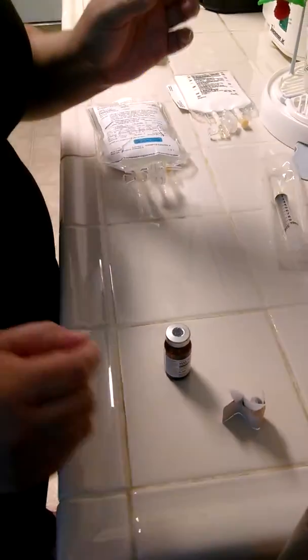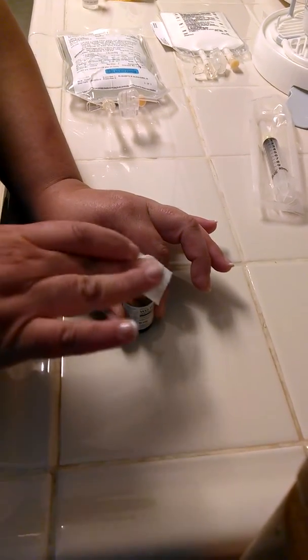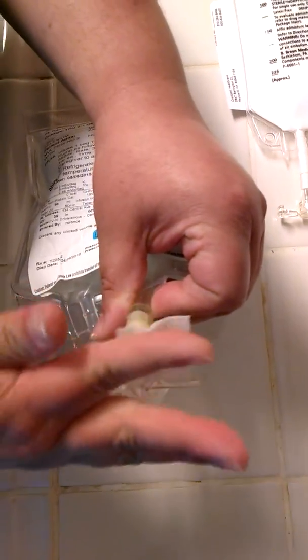Now we're going to proceed to the next step, which is getting the multivitamin into the TPN. Grab your alcohol swab — that's dirty area. Scrub hub 15 to 20 seconds. And we're going to scrub hub the entry of the TPN bag — that's going to be your yellow top. Again, scrub hub 15 to 20 seconds. That's ready to go.